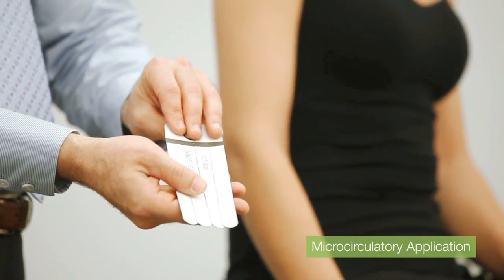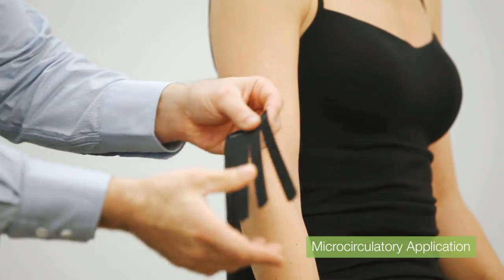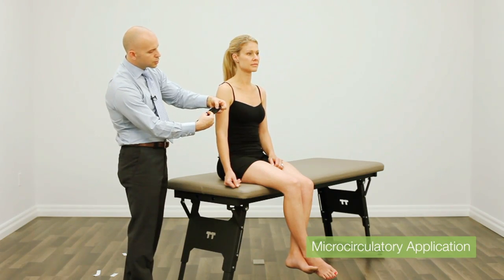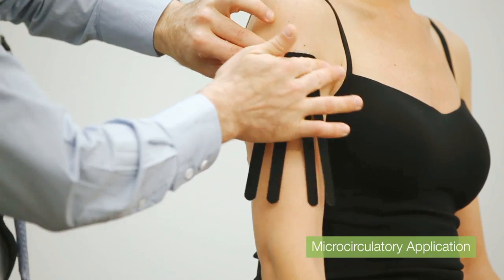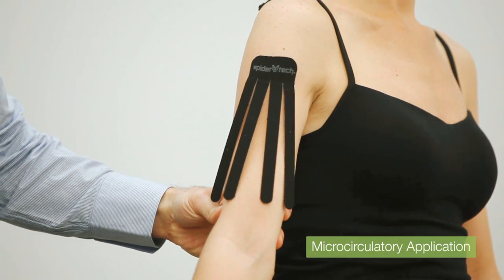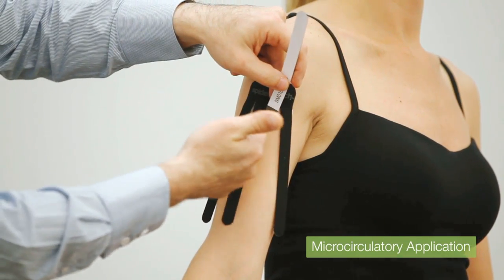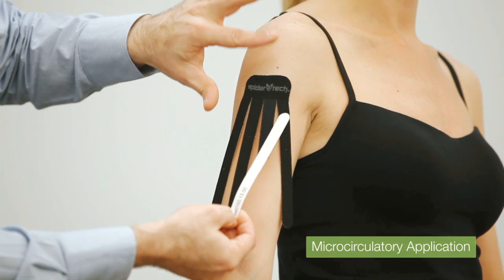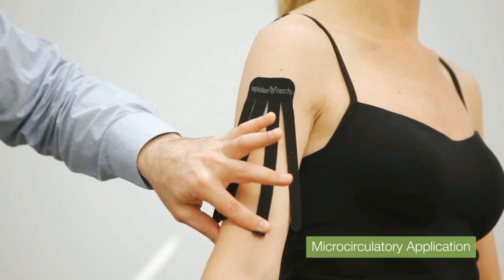We're using a pre-cut application small enough to cover the arm. In our clinical scenario, if we had a nice big bruise, we would take this application, tear along the perforations, place the first portion — or the base of the tape — just above the bruised area, lay the tape down in contact with the skin, and rub over top. The principle is that you elongate the tissue within a pain-free range of motion, then starting from the center and working out, as you peel the backing off the tape there's a little bit of stretch in the tape. Bring your finger behind and lay the tape down in contact with the skin, waiting until about 90% is applied, then remove the backing.